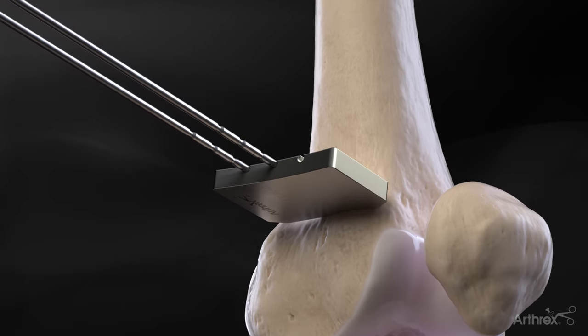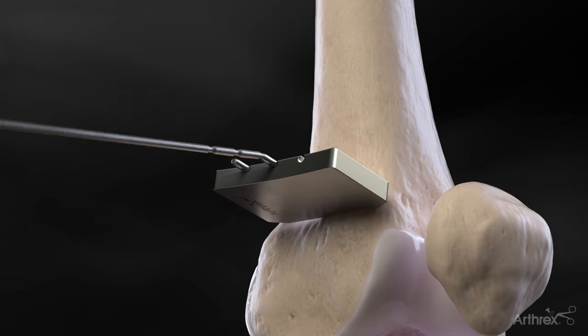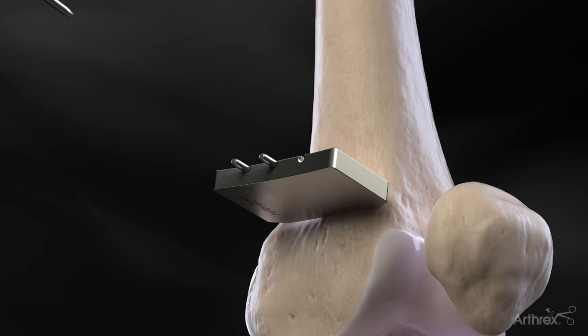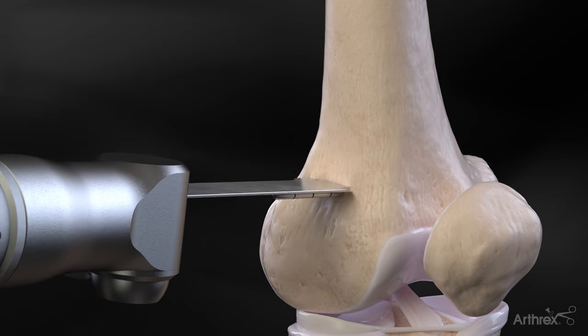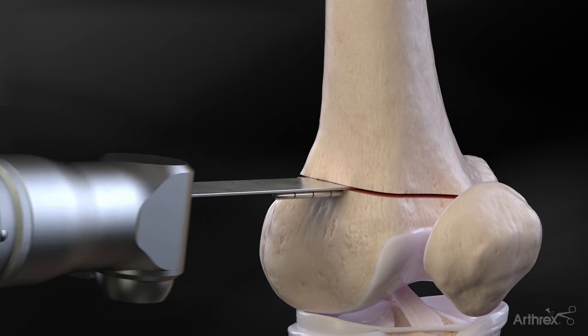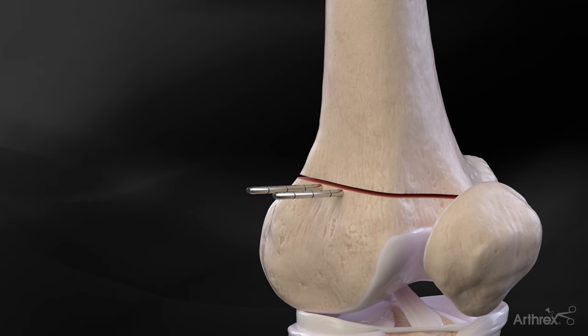Once secure, the breakaway pins are shortened and a sagittal saw is used to perforate the femoral cortex superior to the guide pins. Osteotomes are used to complete the cut under fluoroscopic control, leaving 1 cm of bone intact medially. The depth markings on the osteotome blades may be referenced on the breakaway pins.